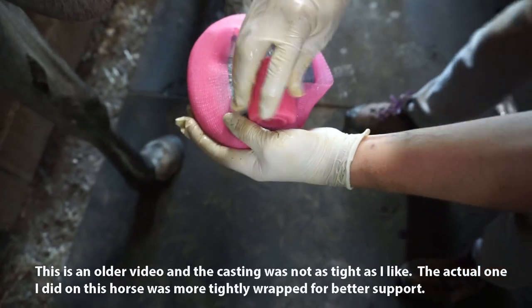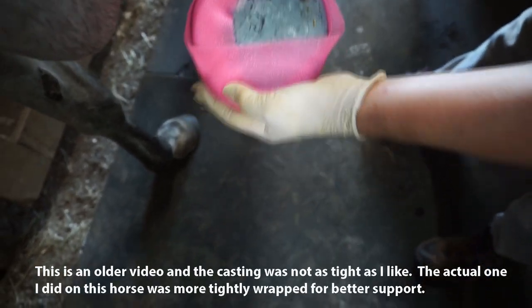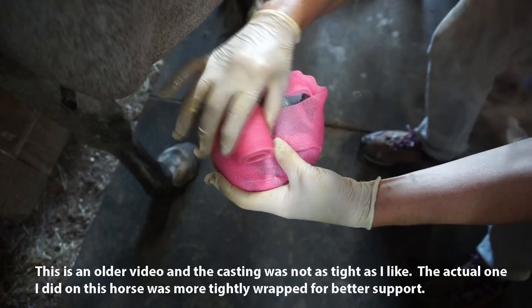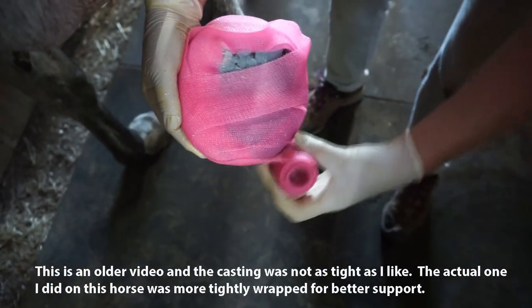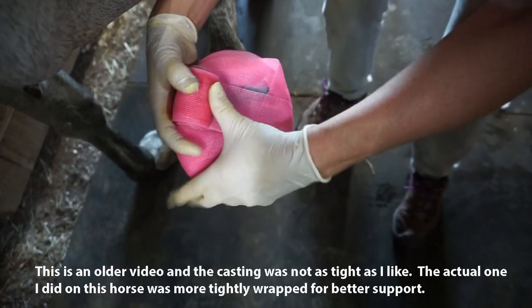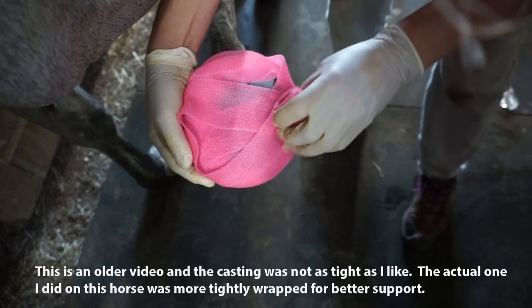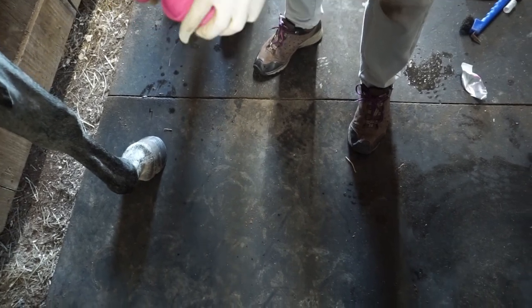So you got to go across, right? You know the drill. Hey, you're okay. Right. So go around this way. So you really got to, you know, you're creating that anew. And you got to think about, I'm giving her a new bottom of her foot. Is what you're doing, right?